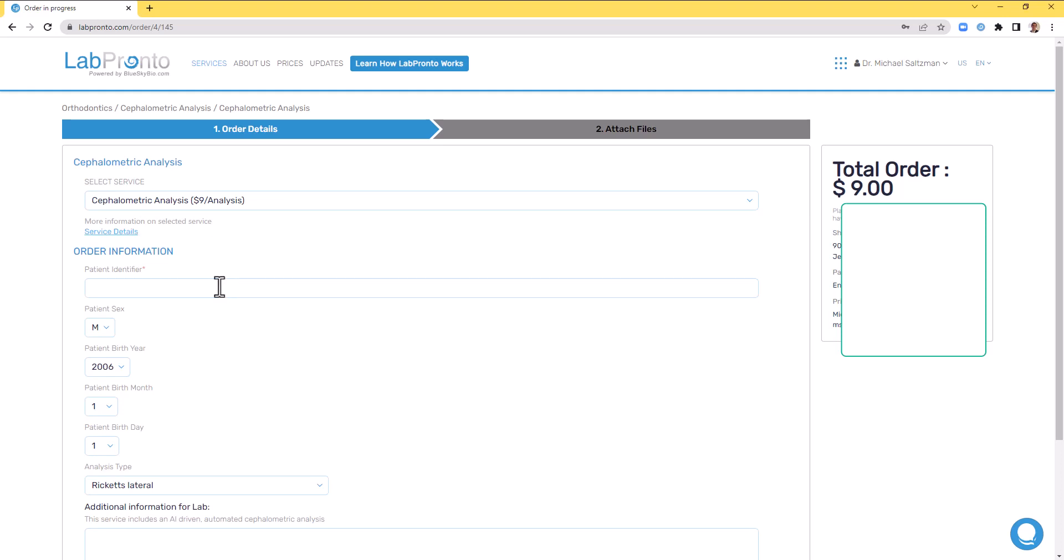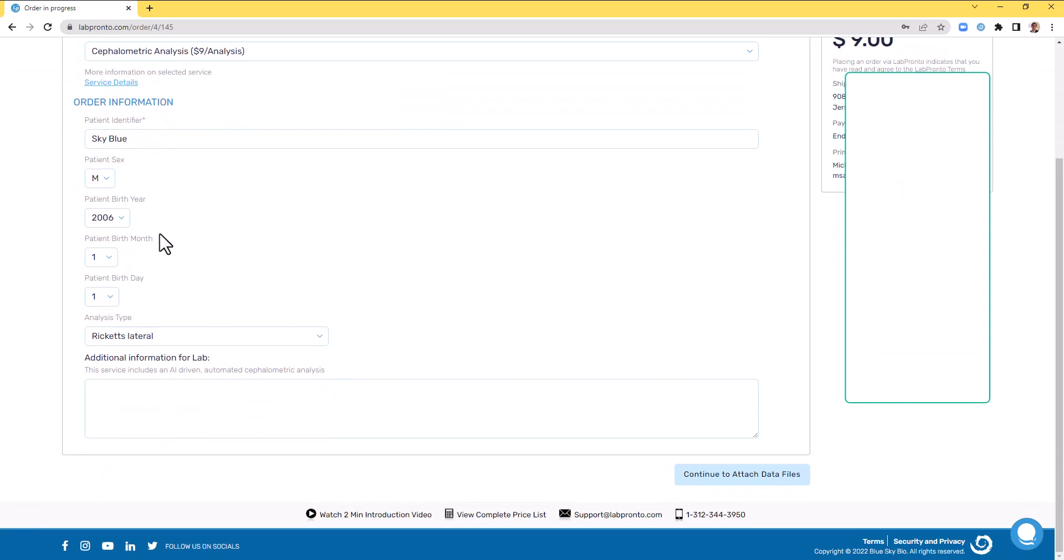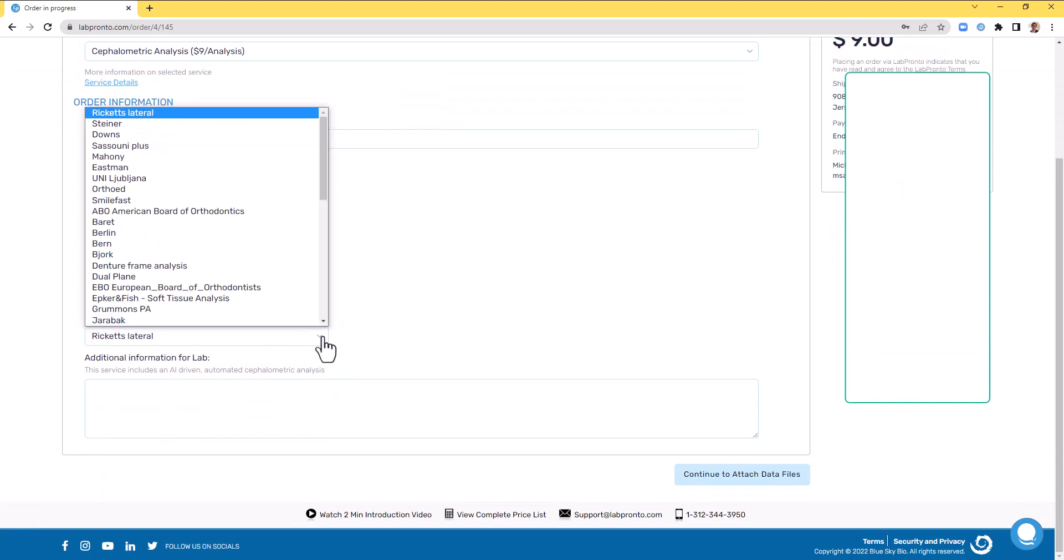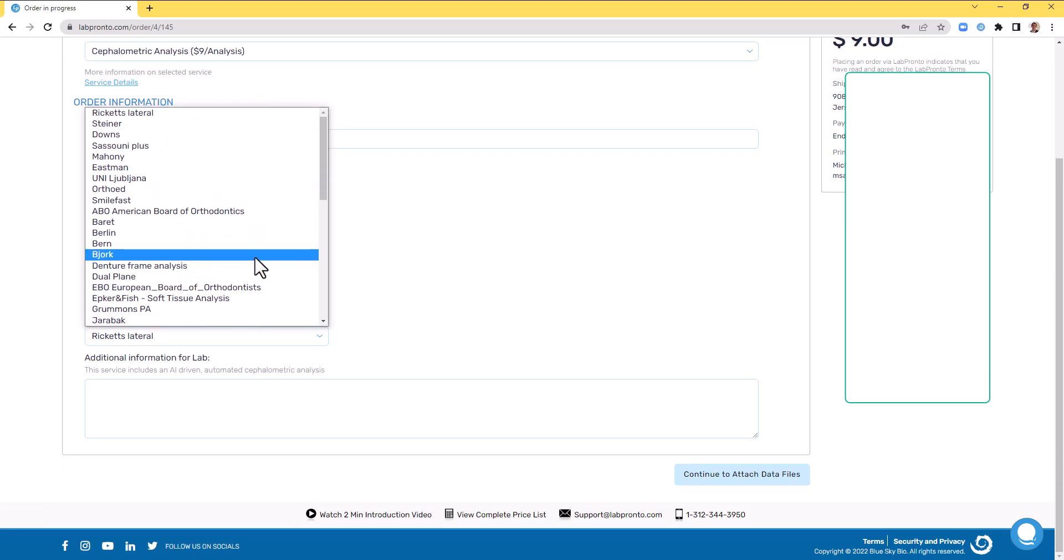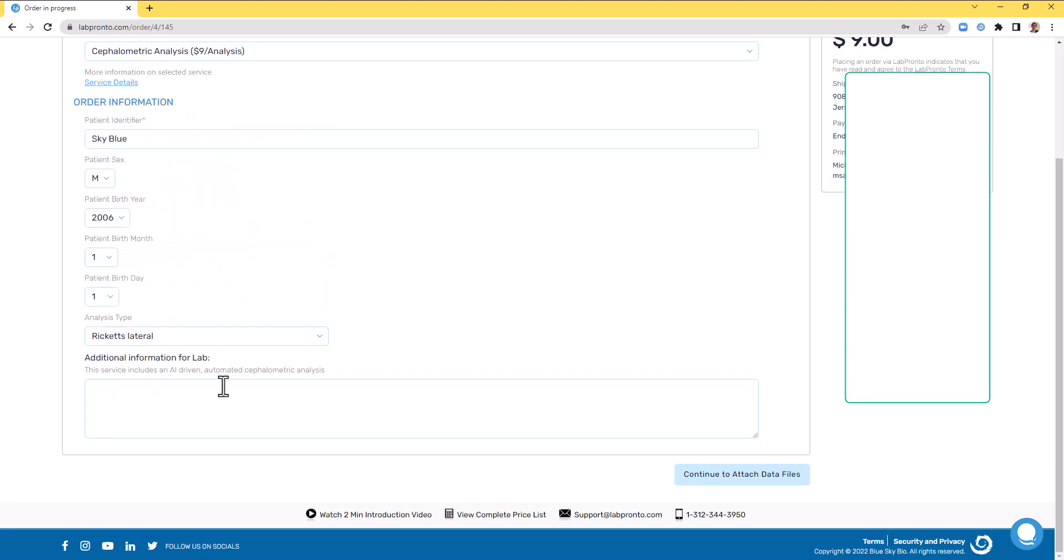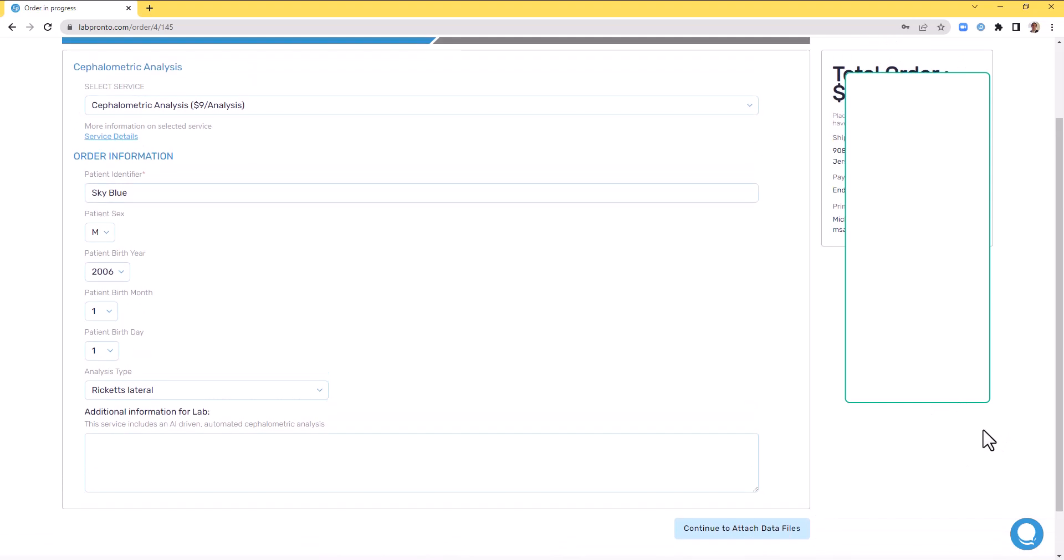I'll now demonstrate the process of placing the order. Enter patient identifier. Enter the relevant details. Select the analysis type, and as you can see, we have a full list of different types of supplementary analysis. And then click continue to attach data files.